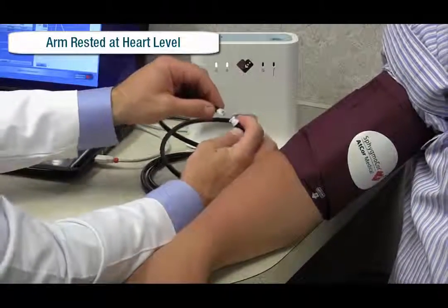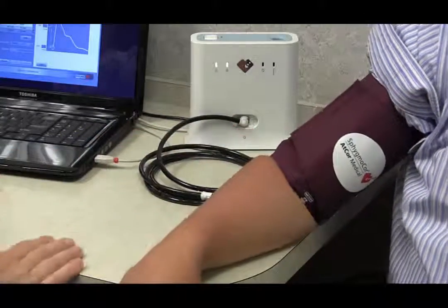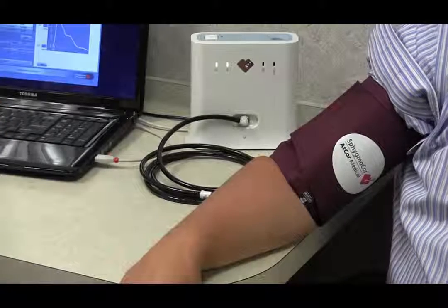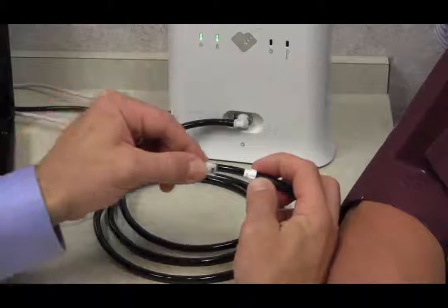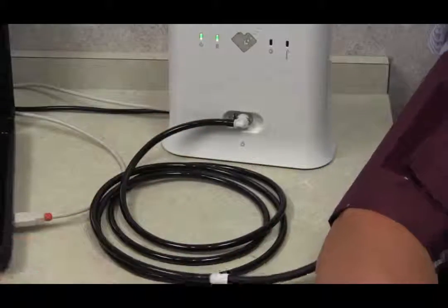Attach the cuff to the hose from the module using the white plastic connectors. Insert the connector on the hose into the cuff connector and rotate clockwise to secure the connection. An audible click will be heard when the connectors are secure.